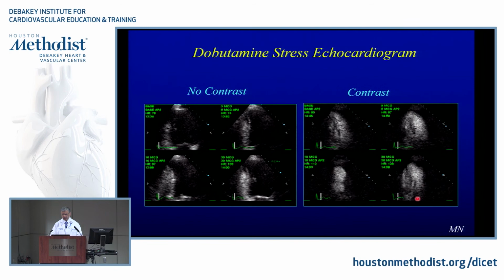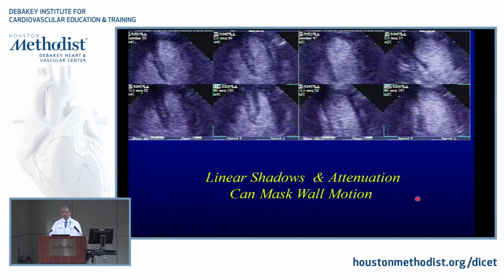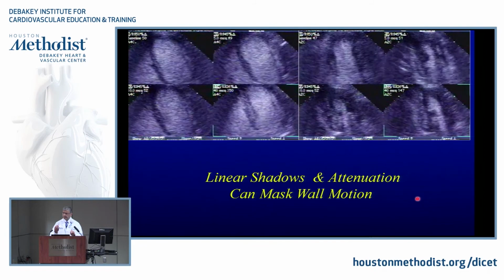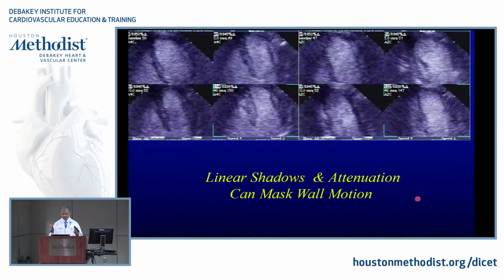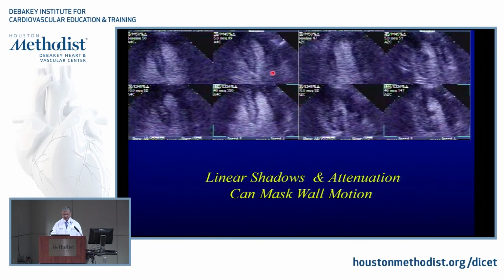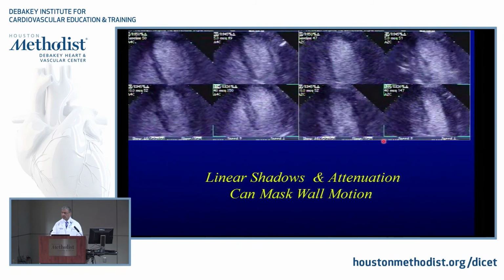Now, few things for you, I think it's important to keep in mind. Yes, contrast illuminates and increases your visualization of the heart. However, it has issues, and you'd better know what the issues are. Once you start seeing linear formation, you know, the heart is not linear. You gotta be very careful, right? And watch this. See how linear this thing is? See how linear this thing is? This is a shadow from a papillary muscle or any other structure that's giving you a linear density. Same thing here.